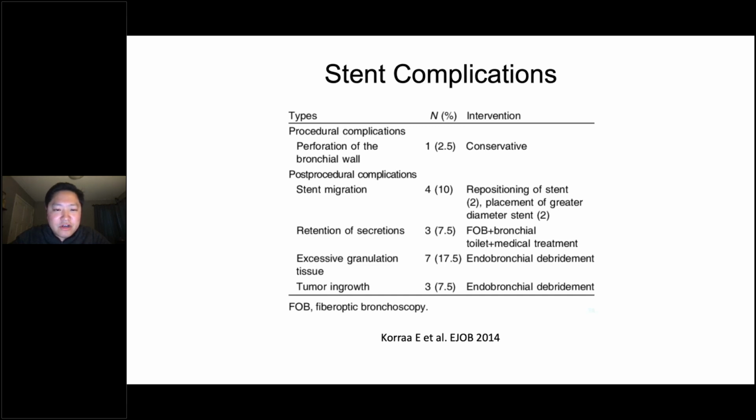But typically, in our experience, most of our stent migration comes when we place a stent in a malignant airway, and they're undergoing treatment, and then the stent becomes smaller than what you intended it to be, because the tumor has resolved and the airway caliber is bigger. You do expect it, and you tell patients that the stent may move because you're getting treatment, especially if they respond. So stent migration, for us, that's the typical scenario.